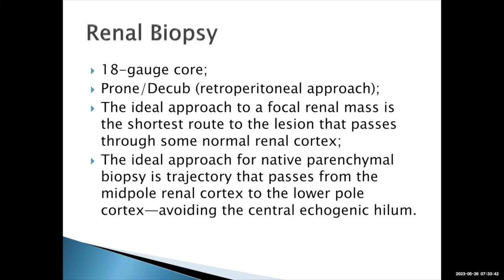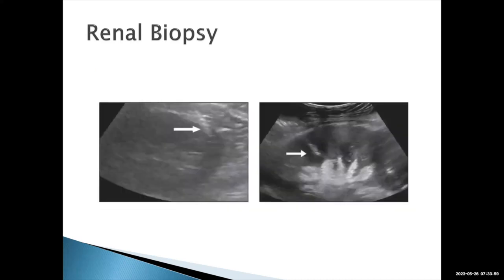Here's an example of a native renal parenchymal biopsy in the sagittal plane. You can see the kidney — cranial end, caudal end — with the biopsy needle going from the mid-pole toward the lower pole cortex, not heading toward the sinus. If the needle gets beyond the cortex-sinus junction and into the sinus, you risk bleeding into the collecting system and potentially pseudoaneurysms. The preferred approach keeps the needle in the cortex. For focal renal biopsies, we generally do two to three core biopsies, which most pathologists find sufficient.